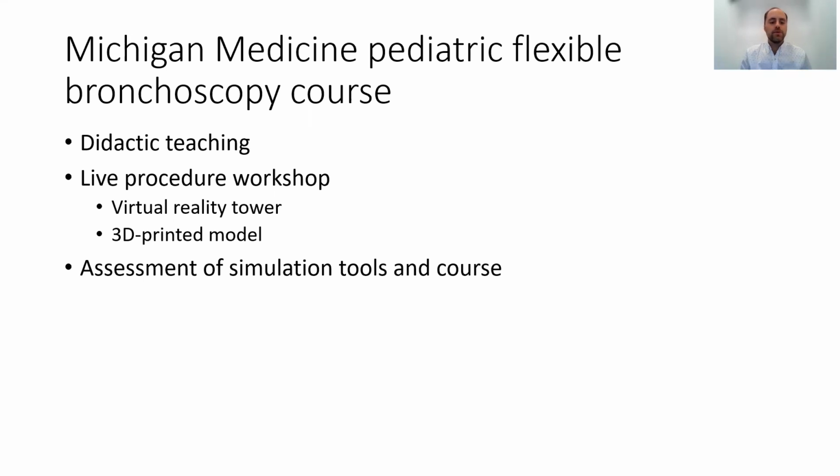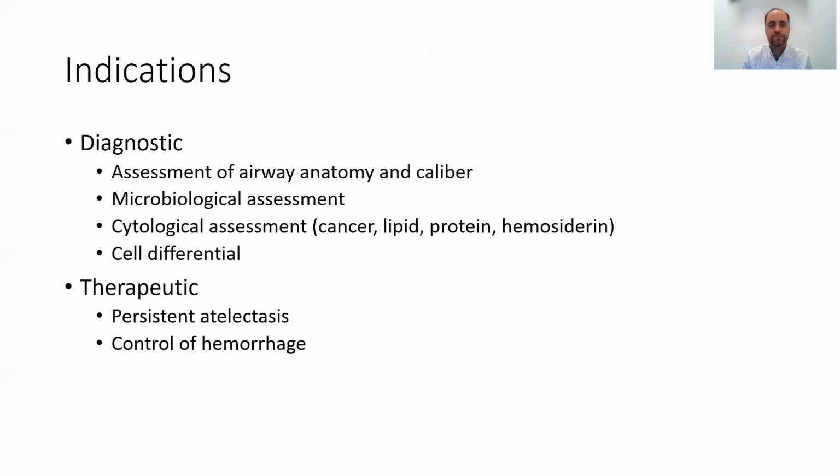It will also include hands-on training in a live procedural workshop, which will include a virtual reality tower and a 3D printed model. Lastly, we will ask participants to assess the simulation tools and course, and the participants will also receive an evaluation on their procedural competency.